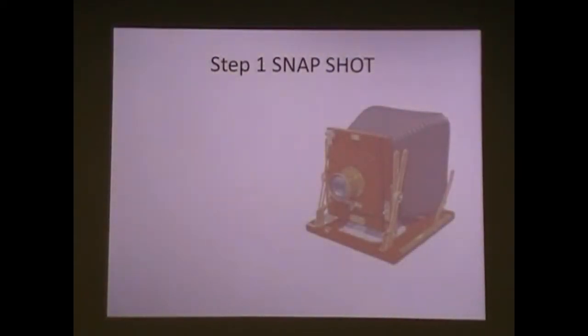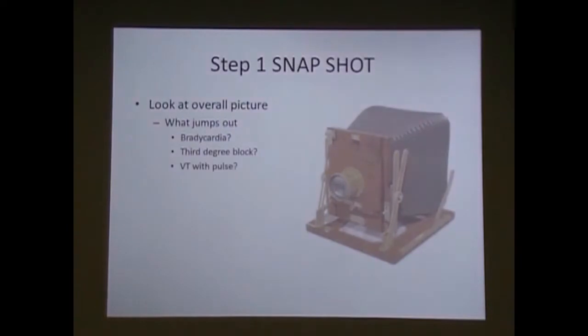So, first step, snapshot. Look at the overall picture. What jumps out to you? Is it Brady? Is it a 3rd degree? VTAC? Does it have a pulse? SVT? Bundle? Those are pacemaker. Are those the things that jump out at you?